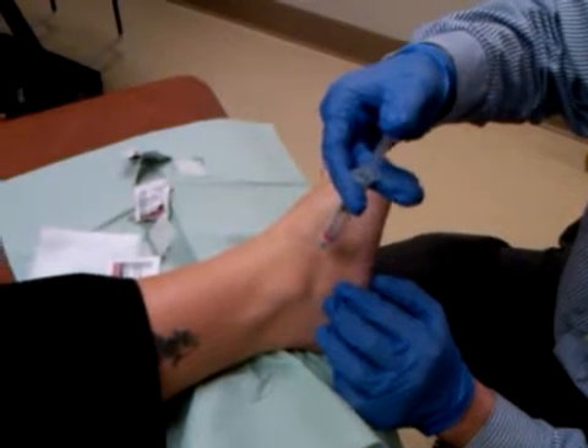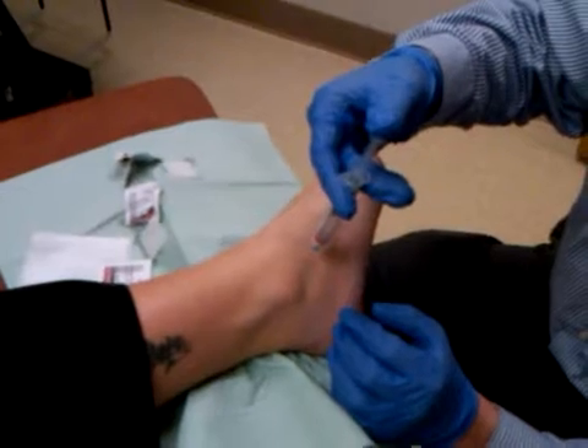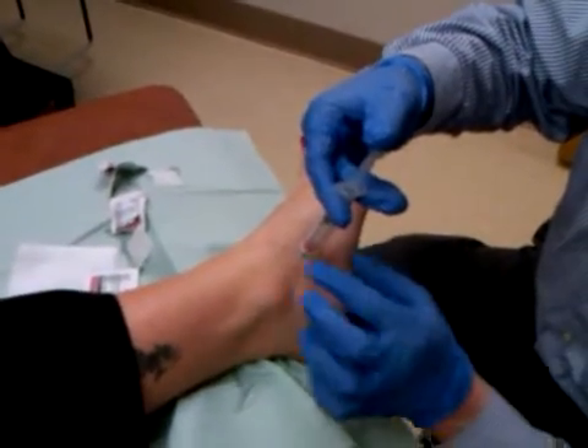I feel a little ache. You're good? Okay. Now, grab the syringe with your hand. Don't try to probe it around like that. What do you mean? Your left hand — like this? Take the right hand... so like that. Like a dart?